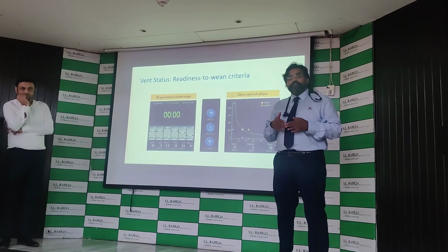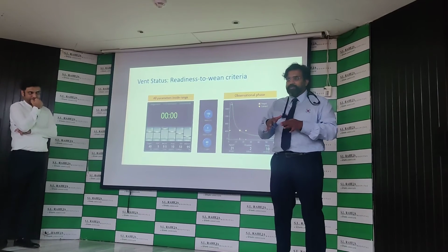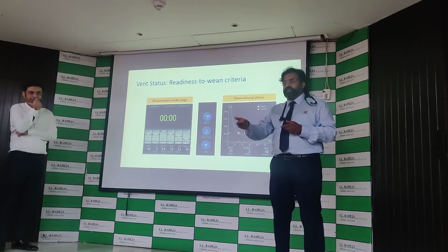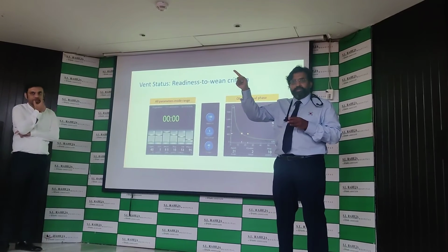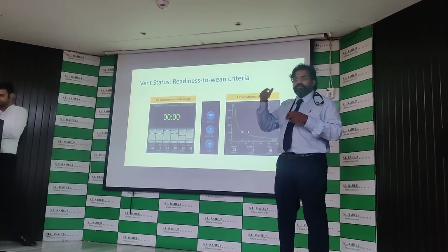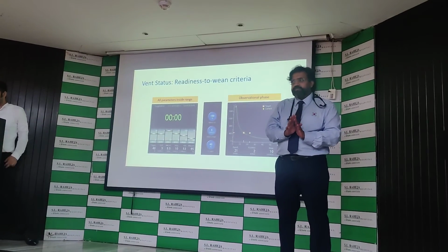Suppose after another 5 to 10 minutes, the patient still remains like that. You can't leave the patient. If he remains like that, what do you do next? Increase it by another 20%. That is why you have the range up to 350%. You understand? So keep increasing it till you reach the point where the patient is now not distressed.